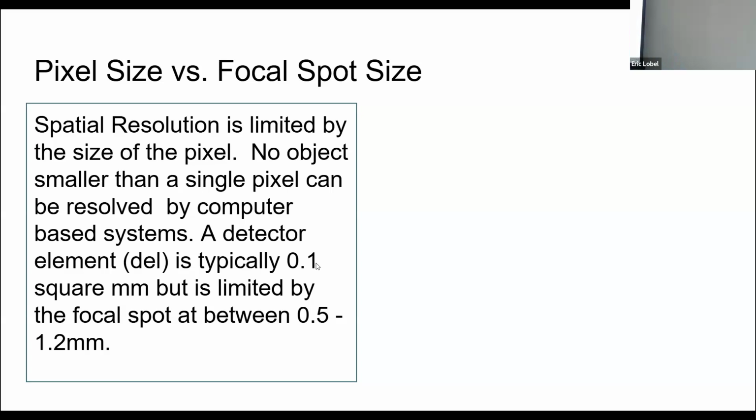There are some small focal spots being used in different types of IR, interventional radiology procedures, which is really fun. I think you get that also from Professor DeVito in addition to physics. I think he basically does the IR course. So that's for angiographic things, right? Looking at different vessels.